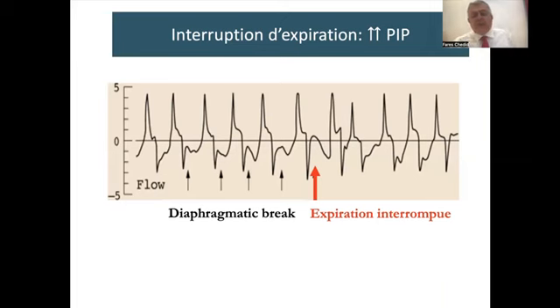So that's interrupted expiration. When there is interrupted expiration, you see that one expired volume is here, then the patient inspires a little bit, then there is another expired volume here. So the system will think that this is the expired volume. It will not add this, and this small expired volume will order the next breath, and the next breath will shoot up. So interrupted expiration can be interpreted as a small expiratory volume and will order a next breath that's much higher. All right?